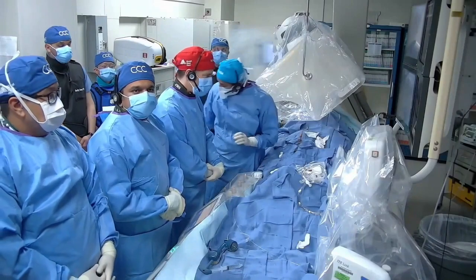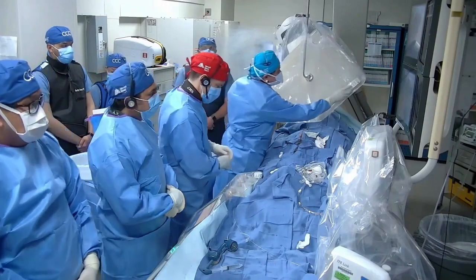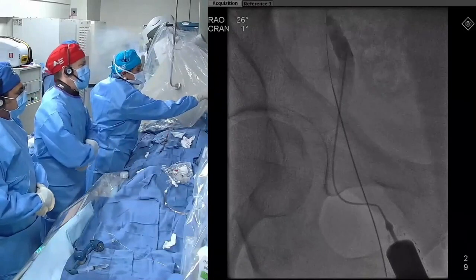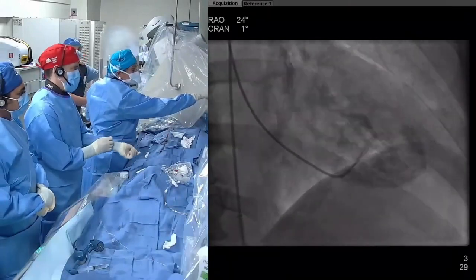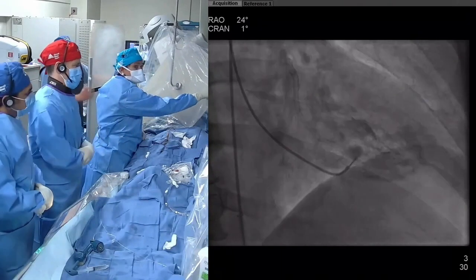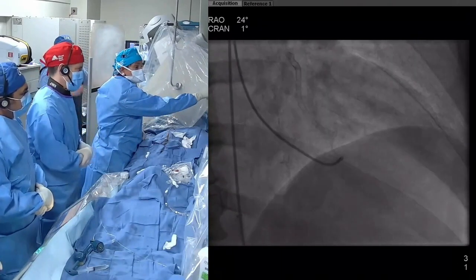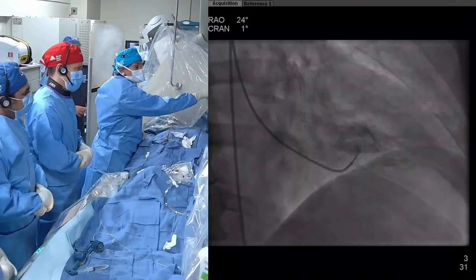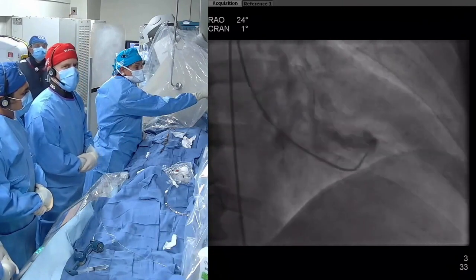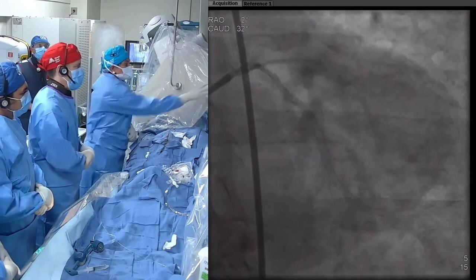And that's where we are. I'm going to show you the angiogram. Before you go, show us the angiogram, because obviously you treated the right coronary and now you're back for the LAD. Yes. Also very important from the diagnostic cath, it looked to me that the ostial LAD might also be involved, but let's just see what you got.